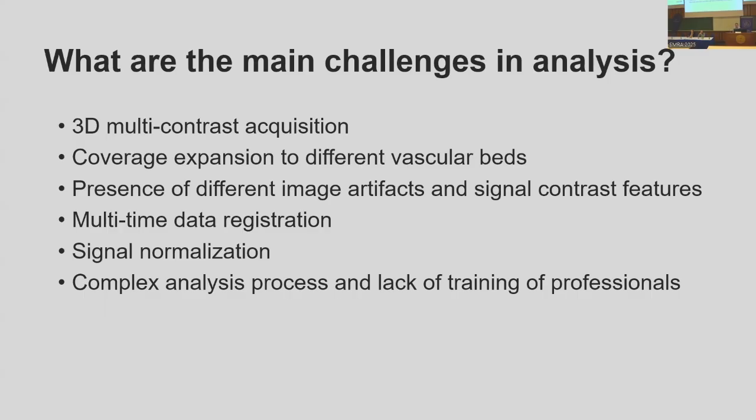But I think the last one is also a big thing: most of the current radiologists are never trained to look at vessel wall imaging in the first place. So even if you provide the best images to them, I don't think they can actually give you a good answer of what they're looking at. So there's a series of challenges once you go beyond stenosis and you want to look at the vessel wall. Those are the fundamental challenges that people have to deal with.